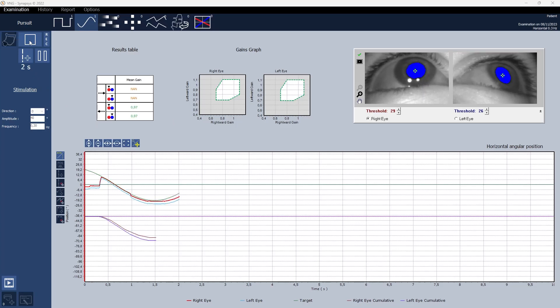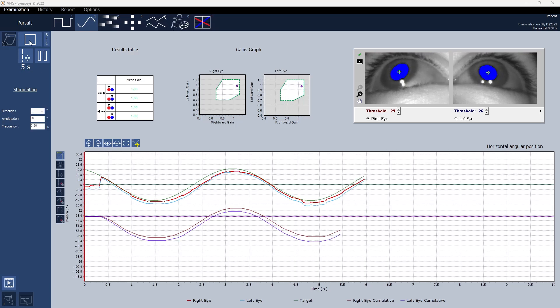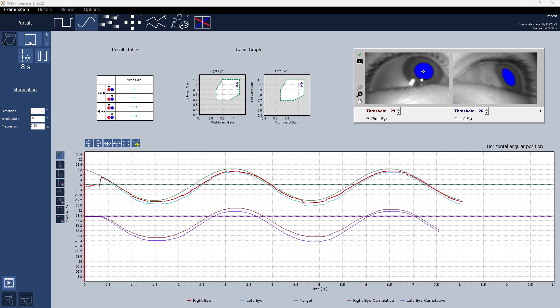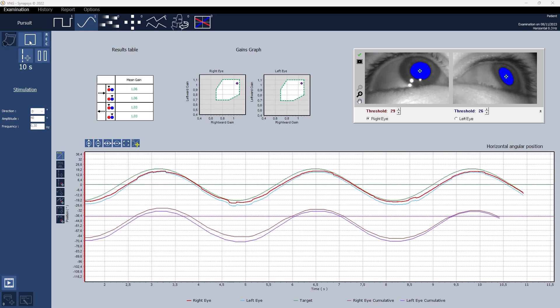Just like the saccadic module the bottom section of the interface displays an angular position graph visually representing eye movements in response to target motion.